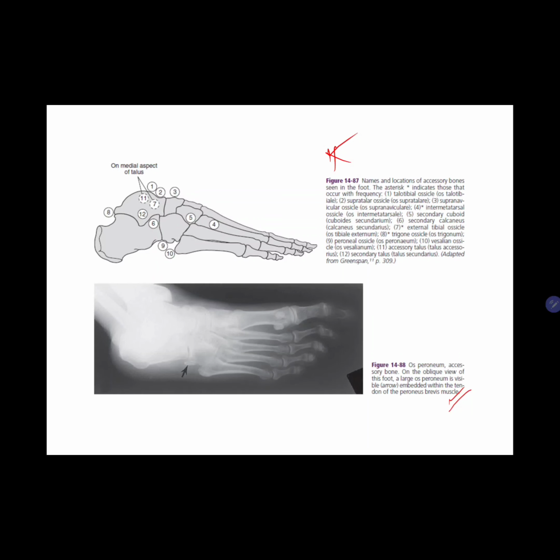For trauma radiography, we talked about the Ottawa criteria. And also, advanced imaging is used when radiographs are insufficient to guide treatment or after the radiographic findings are negative, when further injury is actually suspected. We talked about the ankle sprains, the different tendon pathologies, ankle fractures such as the unimalleolar, bimalleolar, and the trimalleolar fractures.